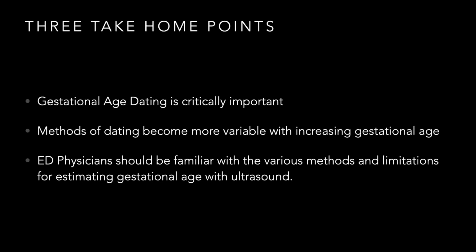So just as a brief recap, there's really three things I want you to take home from today's talk, right? Three take-home points to remember. Number one, gestational age dating is really, really important, right? We may not think about it all the time and routinely, but knowing how far along a pregnancy is really important. I would say it's probably similar to knowing the age of your patient, right? You're going to manage a patient very differently if they're in their 30s than if they're in their 60s, right? And so having that understanding is critically important.